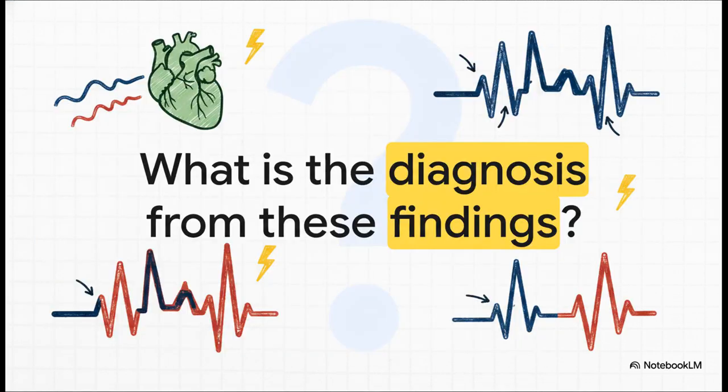Let's move on to our second bedside scenario. This patient's ECG is showing ST elevations down in leads 2, 3, and aVF. But look up at leads I and aVL. There's some definite ST depression there. How are we supposed to put these two puzzle pieces together?